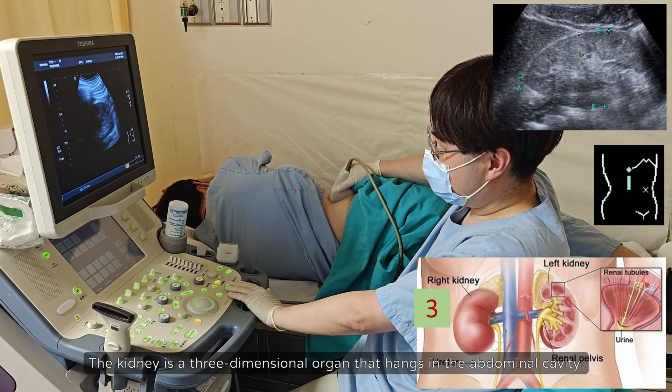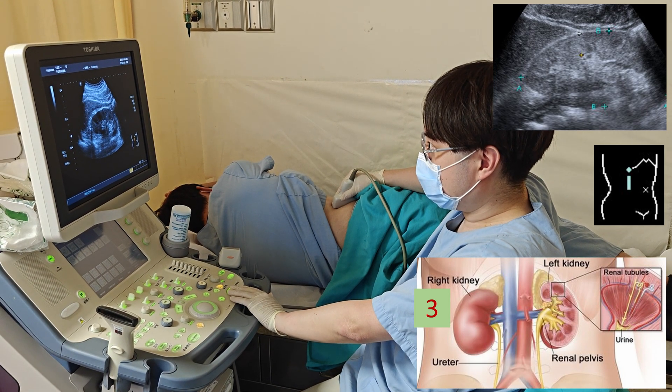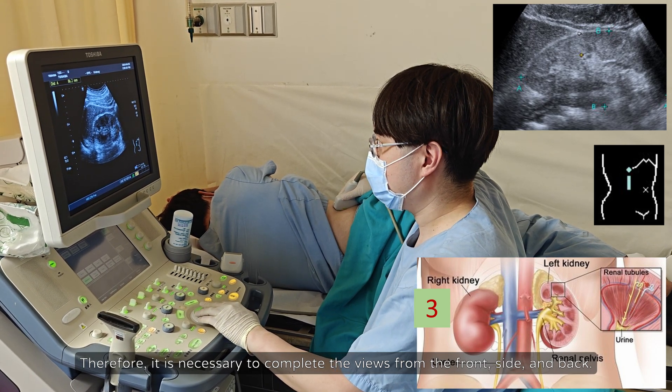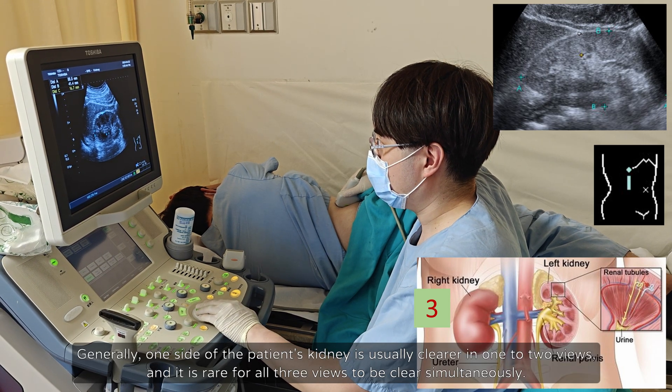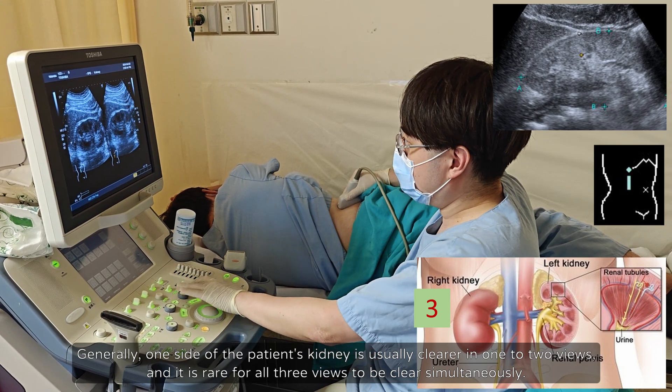The kidney is a three-dimensional organ that hangs in the abdominal cavity. Therefore, it is necessary to complete the views from the front, side, and back. Generally, one side of the patient's kidney is usually clearer in one to two views, and it is rare for all three views to be clear simultaneously.